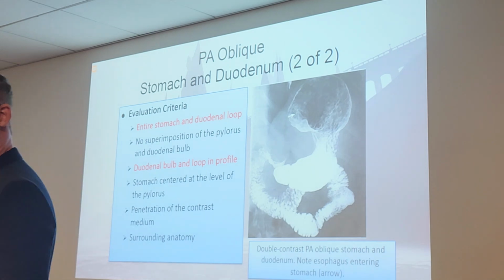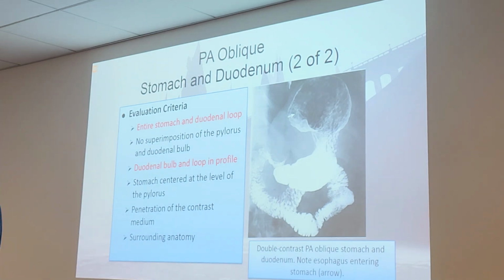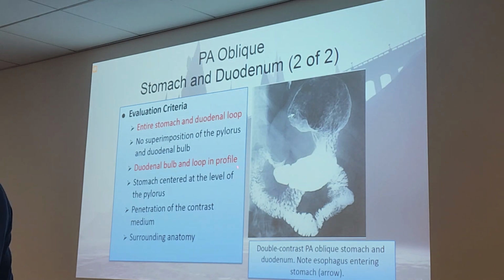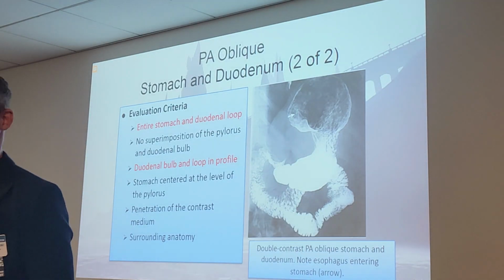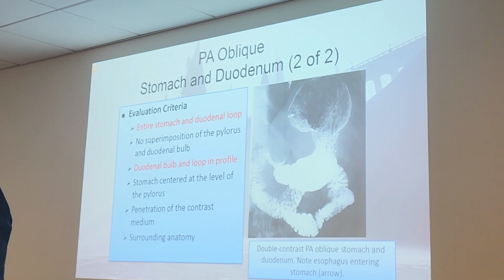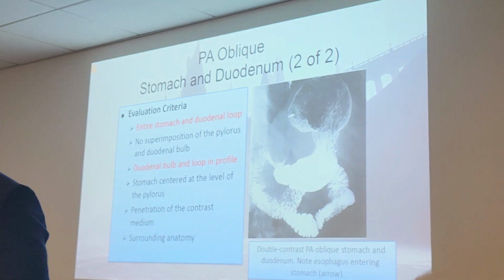There's the fundus. There's the body. This is what I'm saying, guys. Every stomach is unique. You'll never see two stomachs that look alike. They're all vastly different in size, which is why it's such a pain to get these all in one single film. Because you can do the most optimal centering, be the best tech in the world, and you'll still miss it sometimes, just because the stomach's so weirdly shaped. And so they clip the fundus and they clip the C loop.